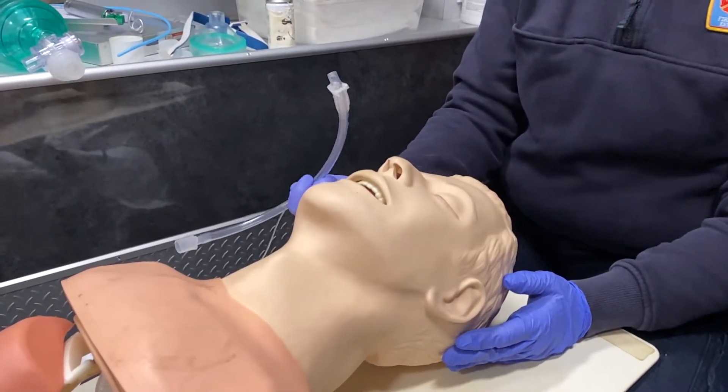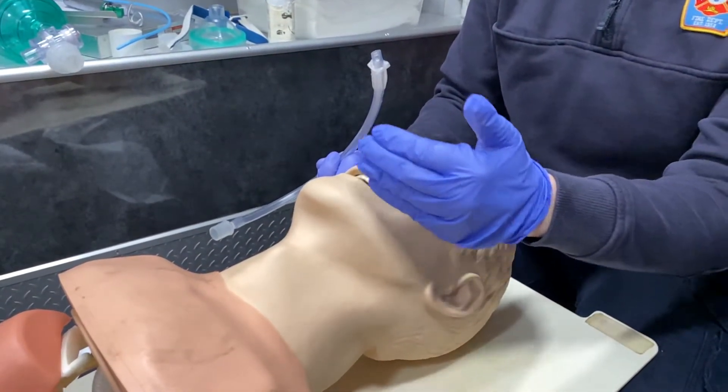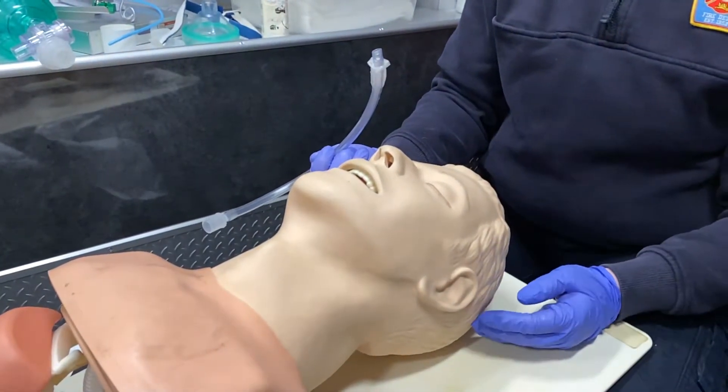So this is used for a patient when we could not visualize an airway — whether it be some kind of bleeding coming out of the mouth or some kind of trauma — but they are having spontaneous respirations.